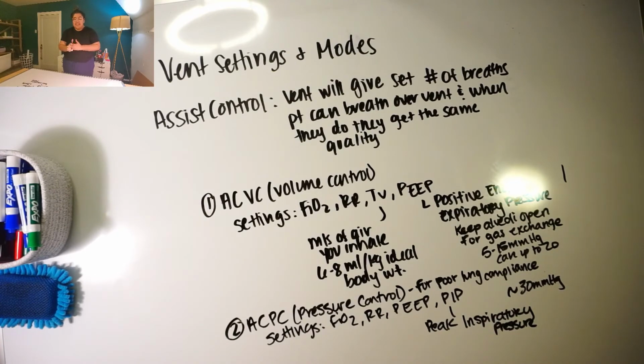But yes, so same thing with pressure control. So it's going to give you the set breaths, but if you breathe over it, you're going to get the same quality. Okay, so this can be good and this can be bad, right?